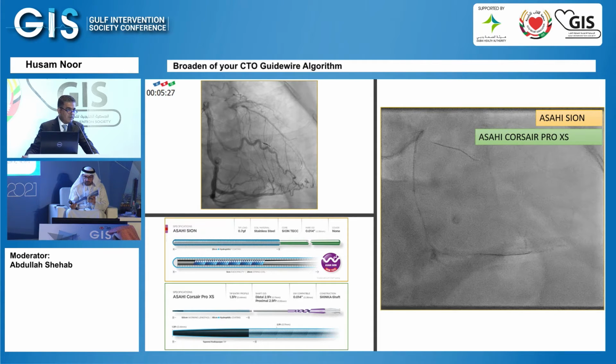An AL 0.75 guide on the right. We use a guide extension for increased support to the right. We have a safety wire in the circ. And we went down with a microcatheter. In this case, we used a Corsair Pro XS for retrograde, and we accessed the lesion.